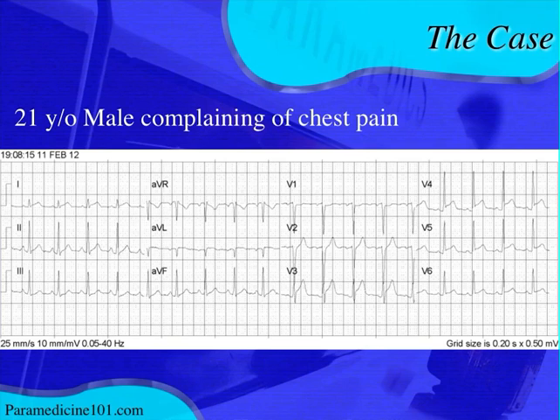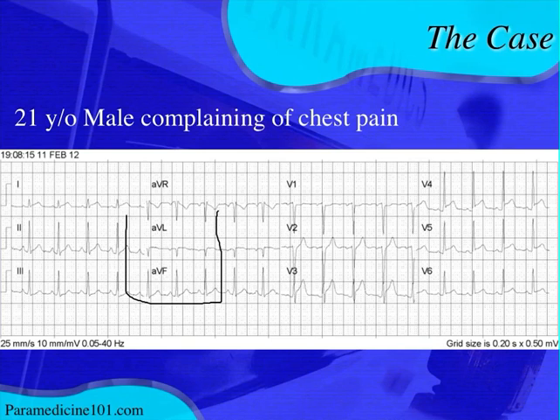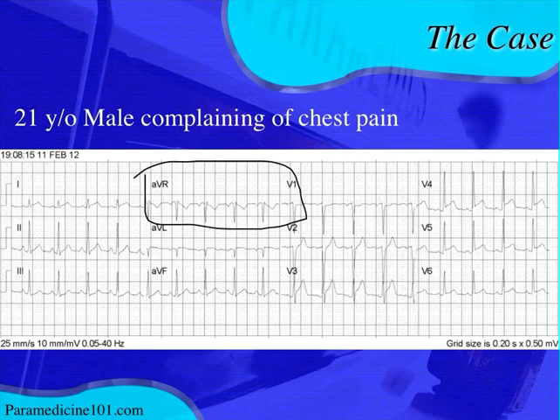Looking at the ECG, we're going to start out by interpreting the rate and rhythm. The rate looks like it might be a little bit fast. If you do your 300 box method, you can see it's almost about 100 beats per minute. The rhythm itself looks probably sinus — we see P waves, they're pretty much upright in all the limb leads and negative in AVR. You see a P wave with every QRS complex, so we can call this a sinus rhythm.